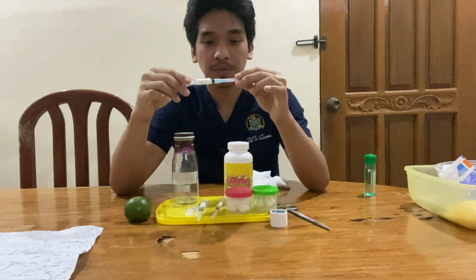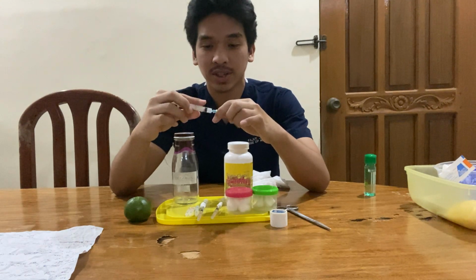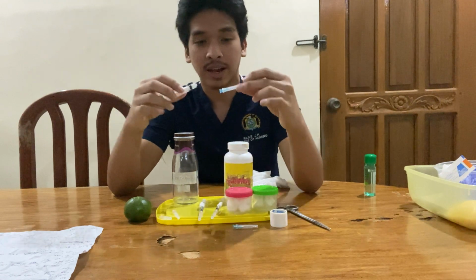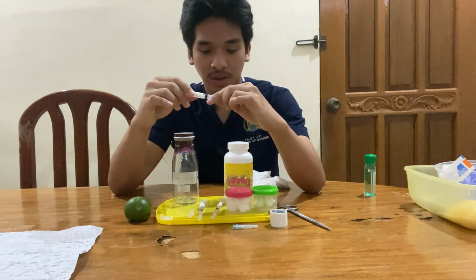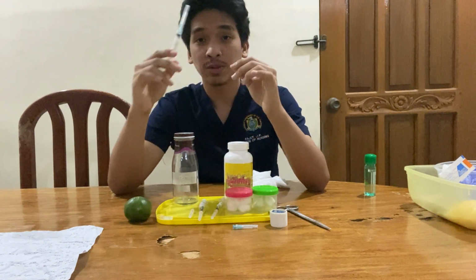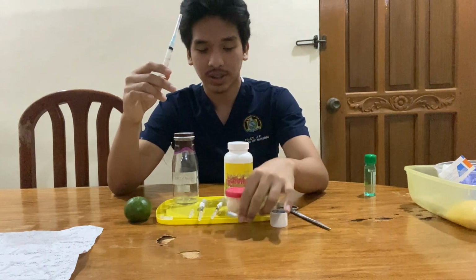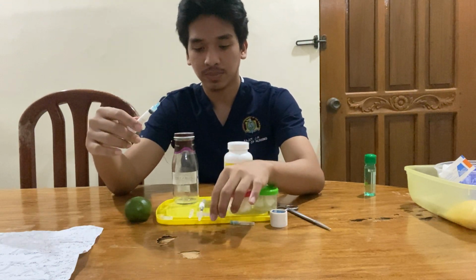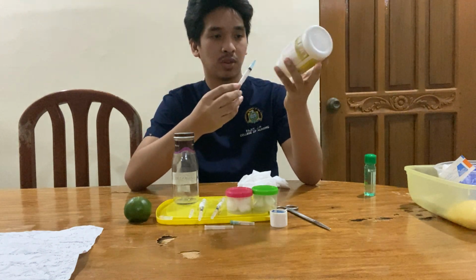To do this, we will first remove the needle that will be used for injection and replace it with a needle that is going to be used for getting the medication. This is to ensure sterility of the needle that will be used for injection. To do this, we'll remove the needle at the cap and then retract.